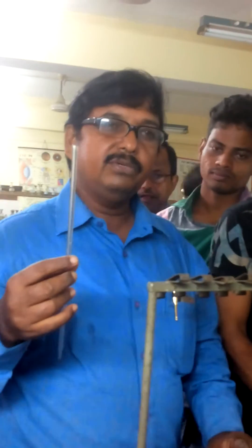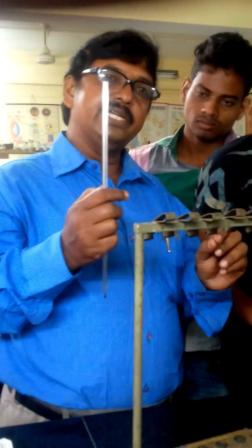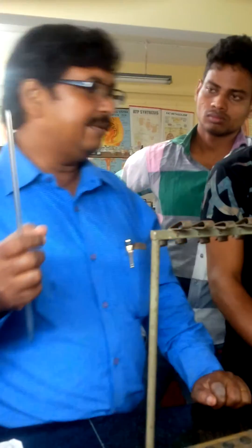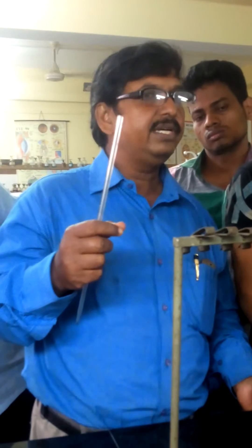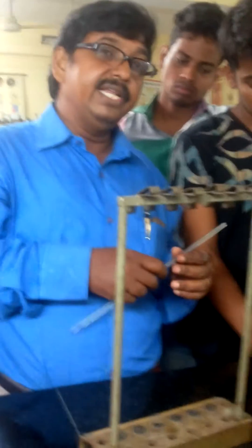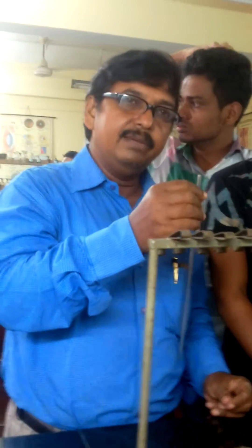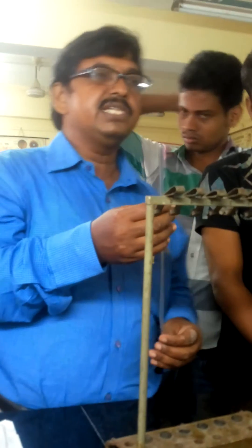We have 2 ml blood from 0.5 ml sodium citrate. We have 2 ml blood — Westergren method. We have to shake it and mix it properly. Then we take the blood from this tube and introduce it to the erythrocyte sedimentation instrument.